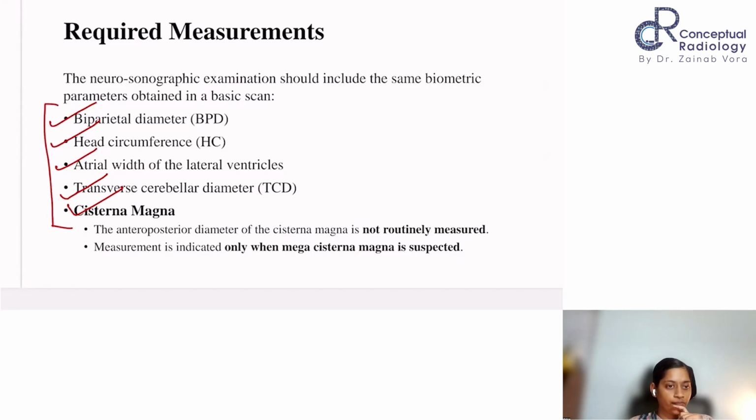For fetal echo, if the spine is anterior, you can ask the mother to take a towel. Or you move your probe. If it is completely anterior and you have your probe here, take your probe to the flank region of the mother. Sometimes it comes. But the best is when you have the spine posterior and the four chamber view is clearly seen with the septum at 11 o'clock position. That is one view which will give you entire axial planes. So that is one maneuver. But again, we cannot do ECV like thing in fetal echo. It is possible in neurosonography.